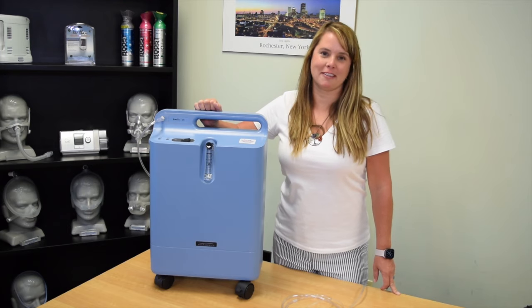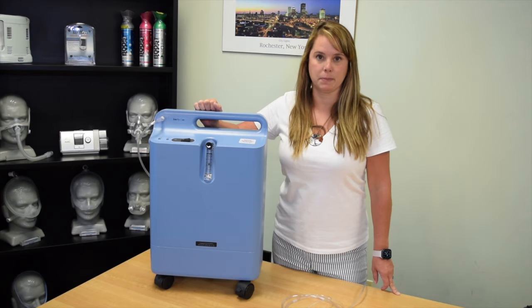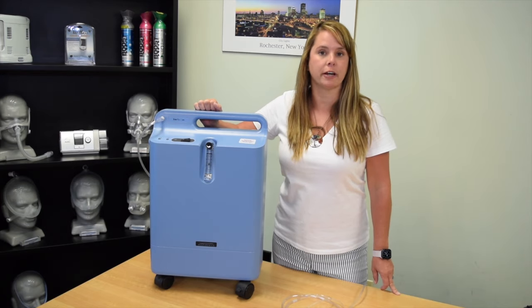Hi, I'm Andrea Hoffman, Respiratory Therapist, and in this video we're going to go over some common issues you may experience with your oxygen concentrator.